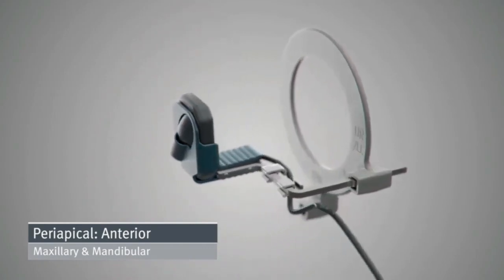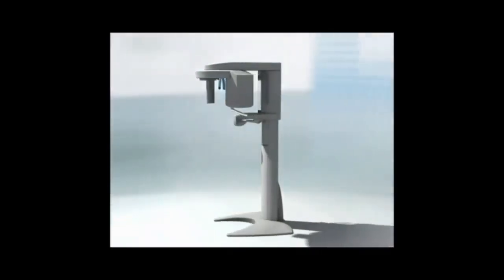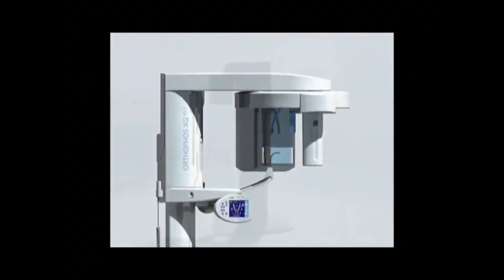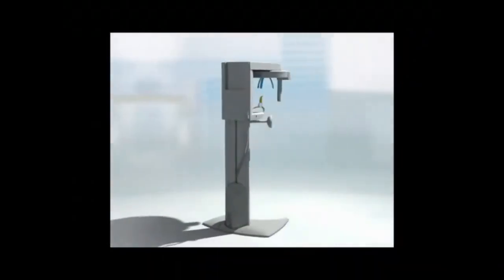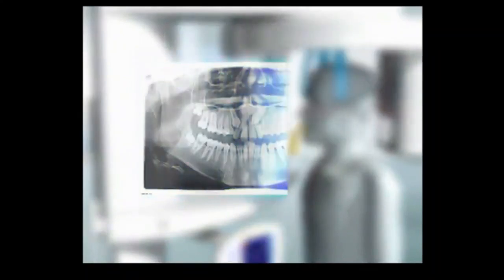The fourth technique is panoramic X-ray. A panoramic X-ray uses a special machine that takes one image of your entire upper and lower teeth. The result is a 2D image of your 3D mouth. If you suffer from frequent complications or have had major dental work in the past, your dentist may recommend a panoramic X-ray every now and then to make sure nothing is brewing.